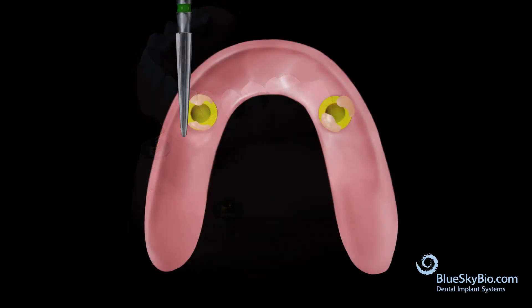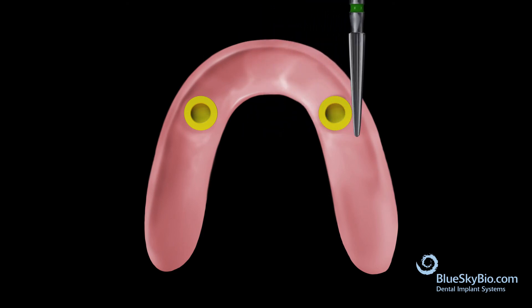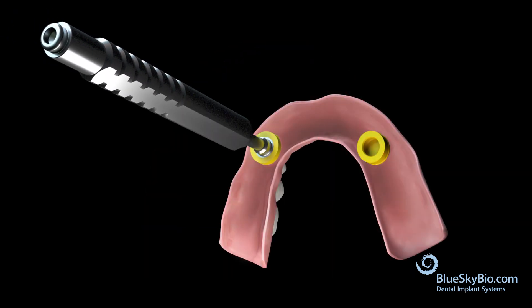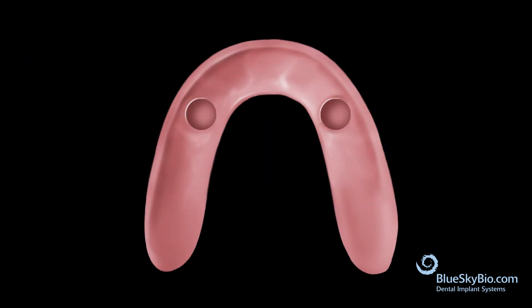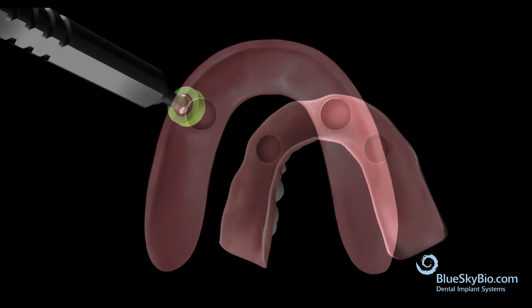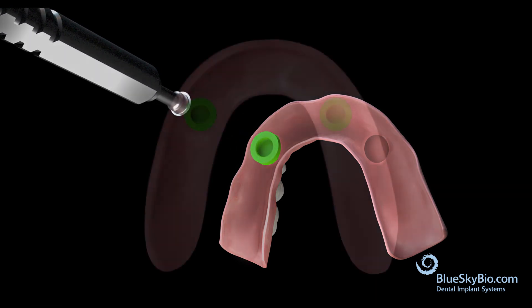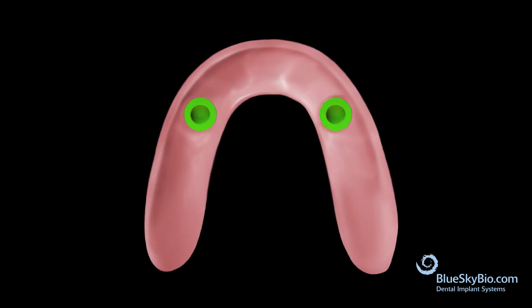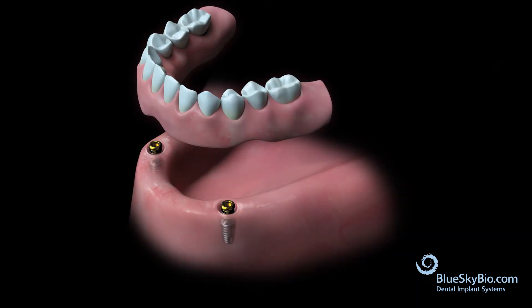Once material has set, remove the denture from the mouth. Trim any excess resin around the insert and ridge areas, then polish the denture. You can either keep the yellow super snap insert in place or use the insertion tool to remove the yellow super snap inserts and replace with the appropriate retentive insert. Remove block-out rings, place the denture into the mouth, and verify proper retention.